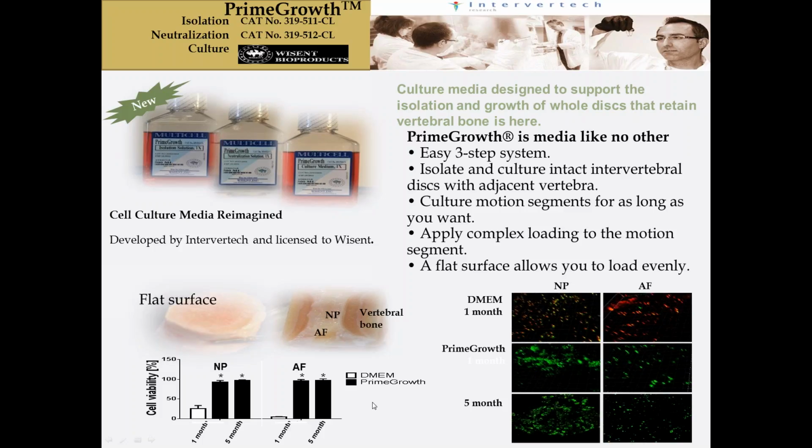You can see here, if you culture in DMEM for 1 month, this is just cell viability. But for Prime Growth, we have been able to culture for 5 months, and one of my students has now gone up to 8 months. So you can culture for long, long times, and this is the longest time that a disc with adjacent vertebrae attached has ever been cultured, more than 6 months. We will send this media to different labs as samples, so that we can do some homogenization of it.